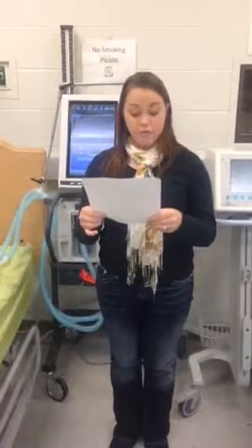Several hours later, she now has the following ventilator settings: mode SIMV, rate of 4, total rate 12, mechanical tidal volume 450, spontaneous tidal volume 400, pressure support of 5, PEEP of 5, and an FiO2 of 28%. Throughout the weaning process, I have closely monitored her vital signs, ABG values, and performed meticulous patient assessment for any sign of respiratory distress.